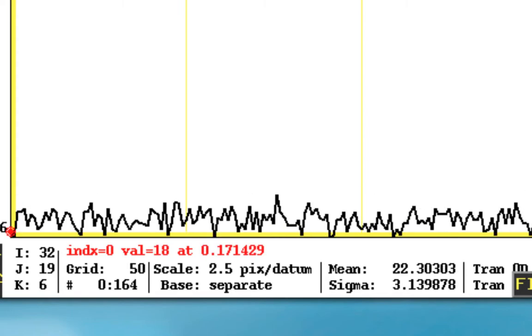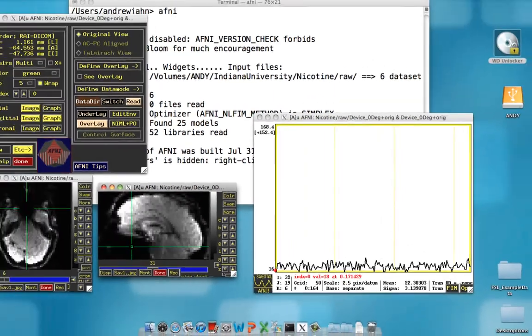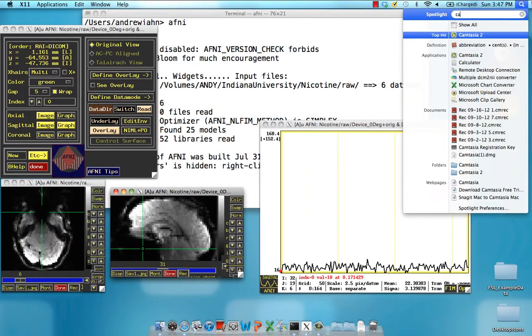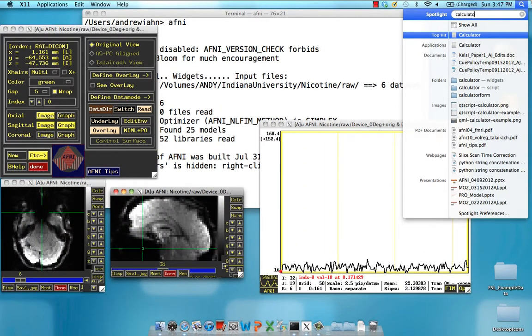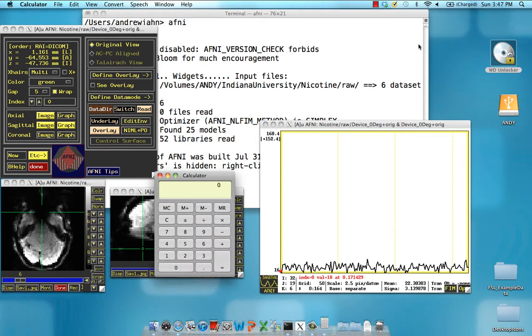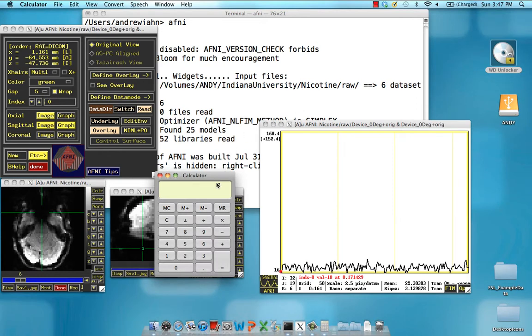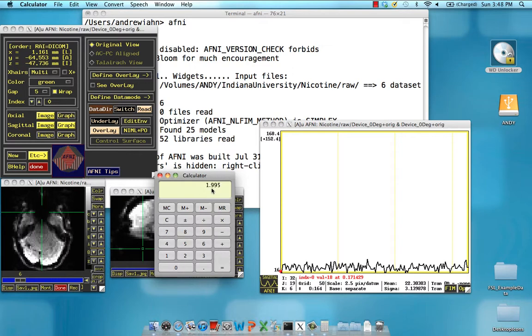So recall that I said the TR is about 2 seconds. Well, it is 2 seconds. If we take 0.57 and we multiply it by the number of slices in this data set, which is about 35, due to rounding errors, oh sorry, 0.057 times 35, there's a little bit of rounding error, but it does add up to 2 seconds.